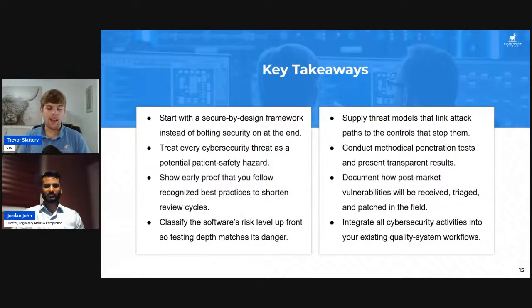Now, on that topic, we can't fix everything. It's impossible to have perfect security in a product. And so when we're moving into this post-market phase, we want to see how we're identifying vulnerabilities, fixing them, and remediating, pushing out these remediations while the device is fielded. It's very important to have a clear process for this, and ideally we're able to execute these updates remotely.